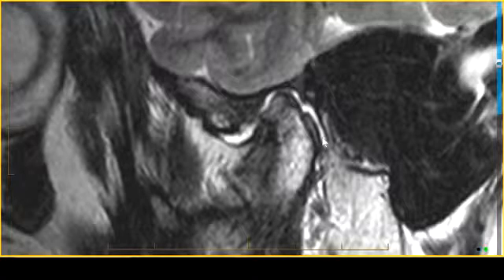This is a 60-year-old lady whose jaw is locked. She's got nature's arthrogram, which is a large effusion tracing out the recesses of the capsule, which you've heard about in other vignettes. I want to tackle how we might grade this TMJ using some of the grading systems you've had before, and how some of them really apply and some of them don't.